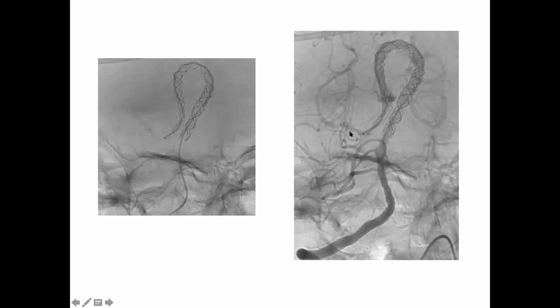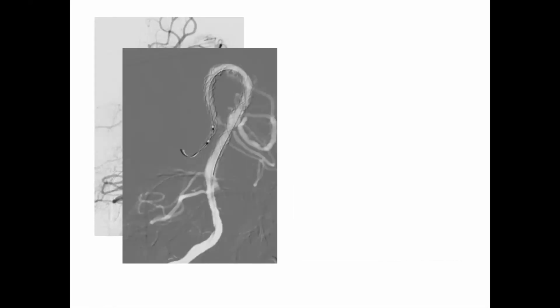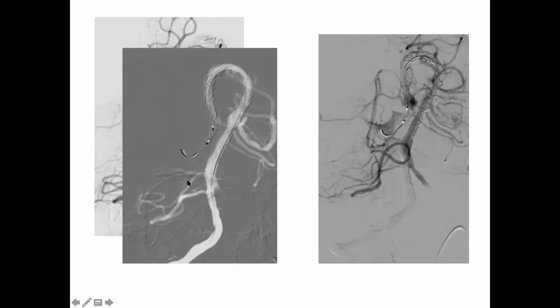When I overlapped more stents, after deployment the patient had a thrombus in the distal part. I decide to perform angioplasty in this part. And during angioplasty, the vessel ruptured.